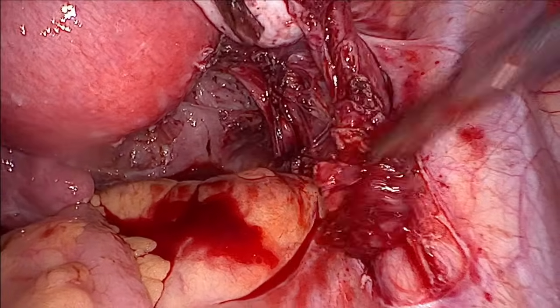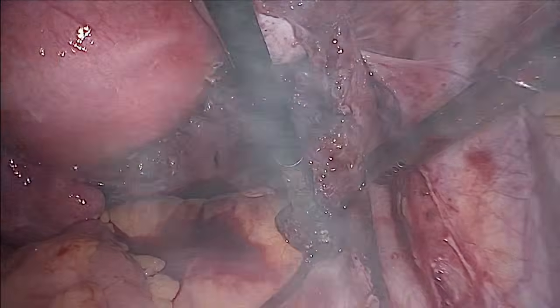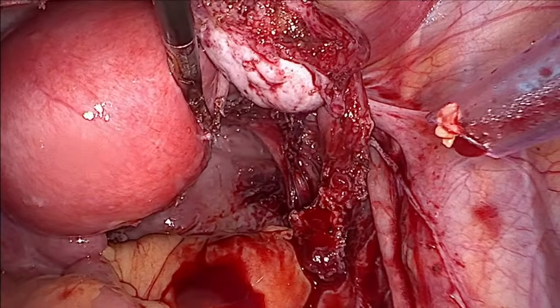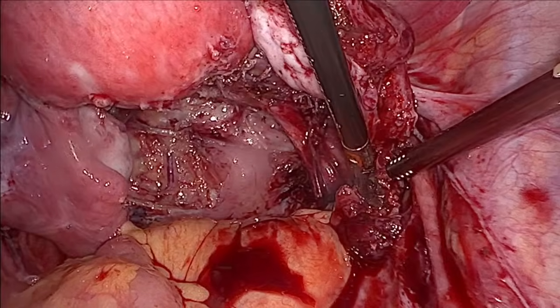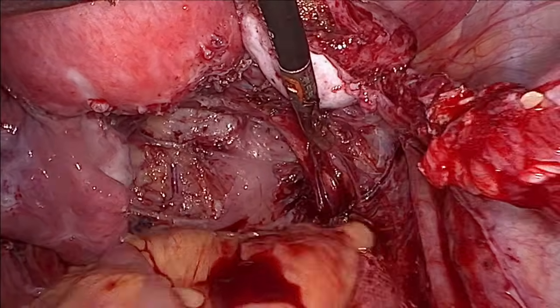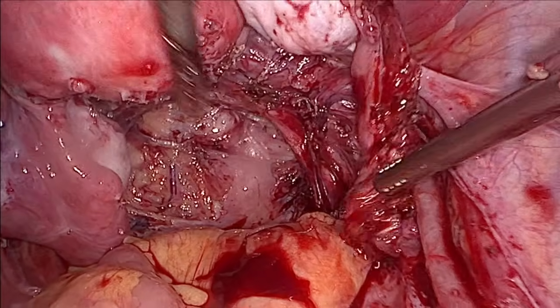Okay, so we have done the methylene blue test, but there's no spill in both tubes. Okay, the tubes are blocked for now.